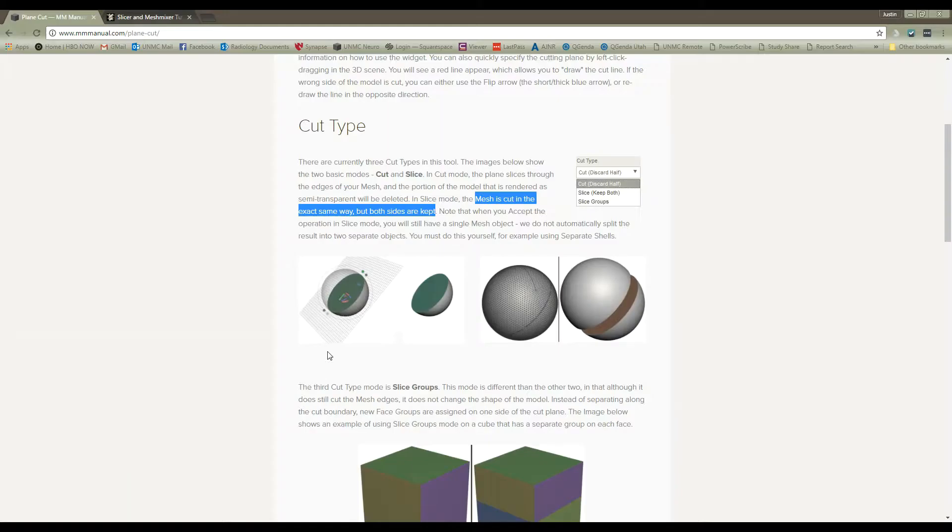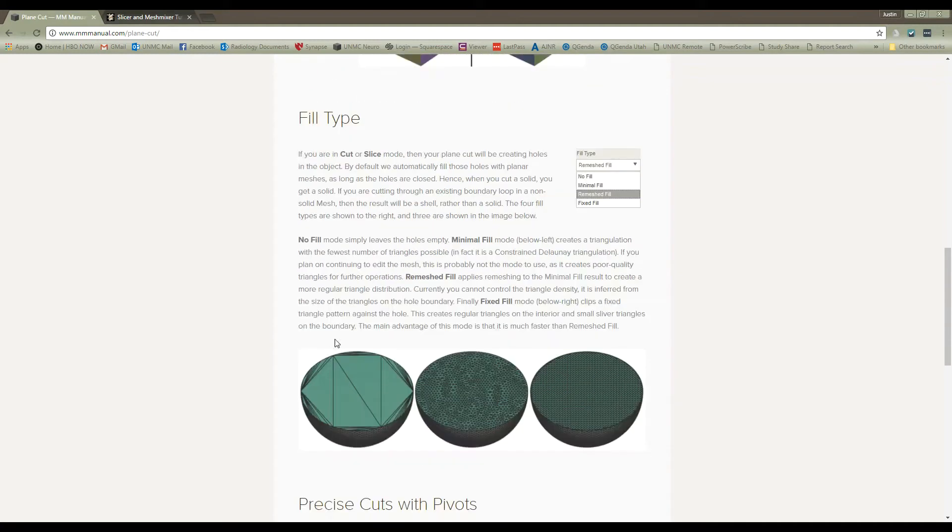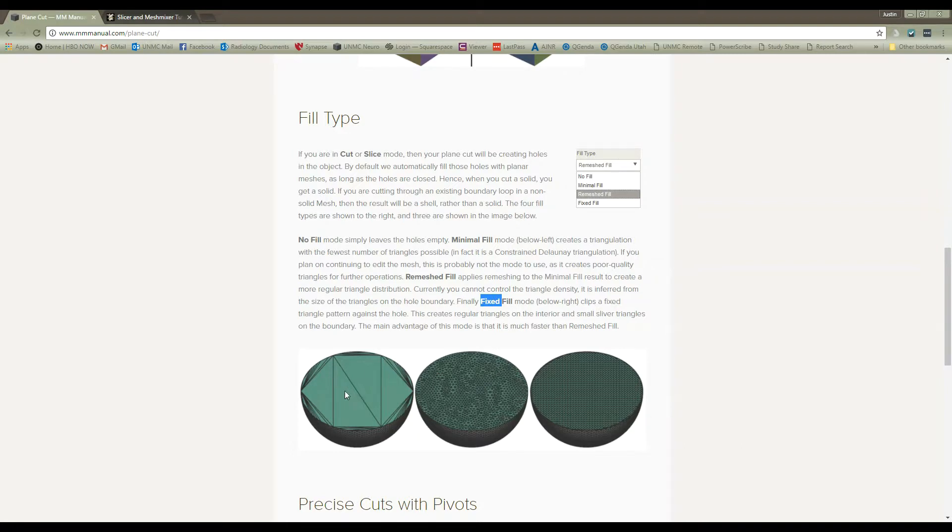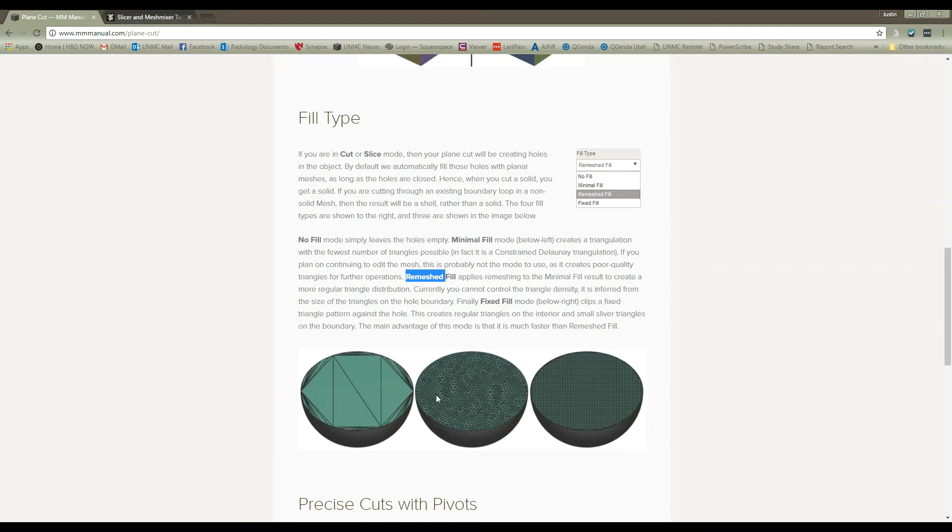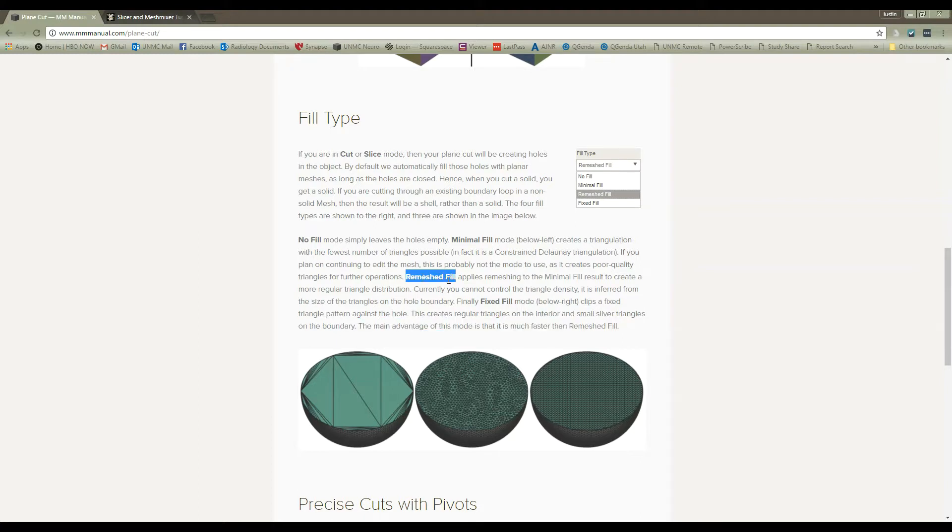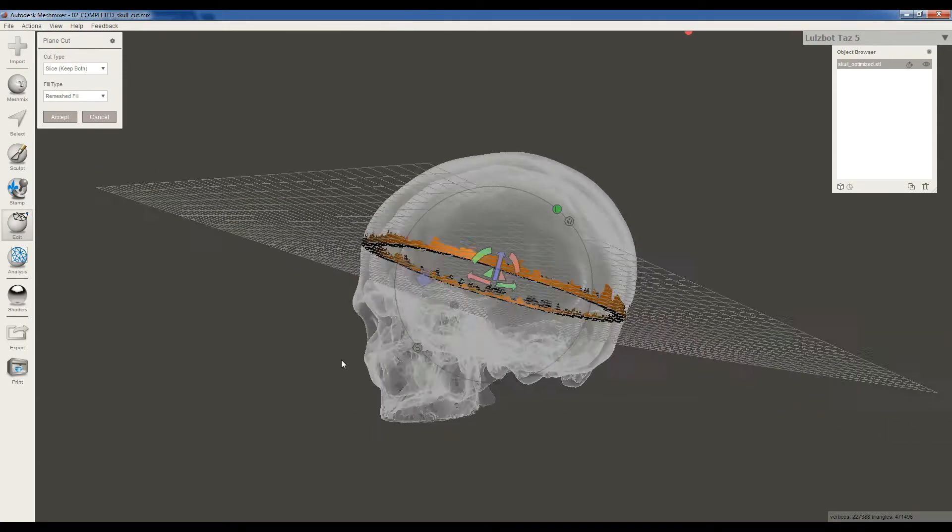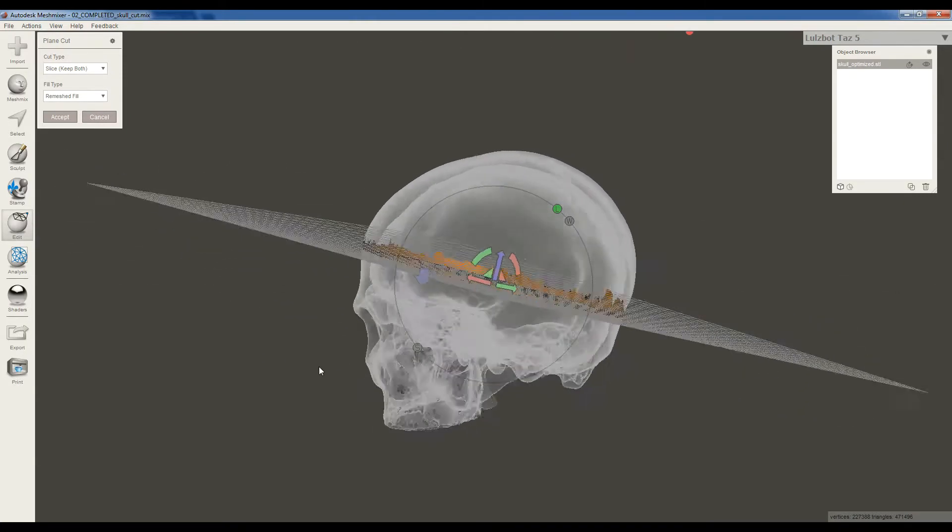And then if we look at the different Fill Types, you can see there's Minimal Fill, Remeshed Fill, and Fixed Fill. Minimal Fill is going to give you the least possible number of triangles. It's not exactly what we want. Remeshed Fill is going to give you a pretty clean, good resolution fill of that hole you're going to make when you cut the skull. And then Fixed Fill, the main advantage is that it's faster than Remeshed Fill. Well, we're not in a hurry, so we can just use the good one, okay? So let's do Slice Keep Both and Remeshed Fill. We have our plane lined up nicely.